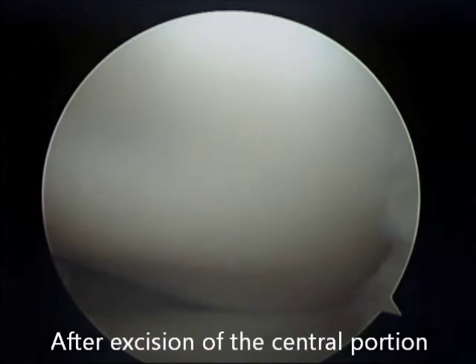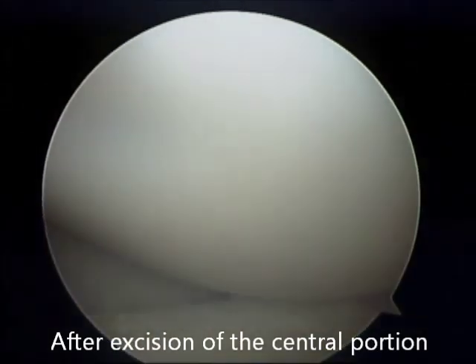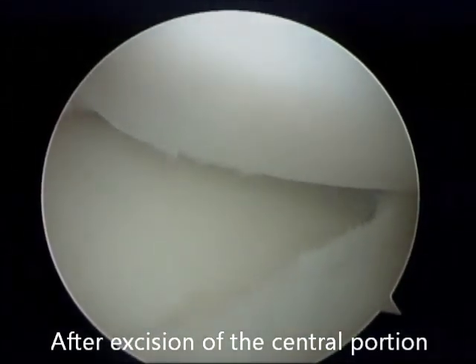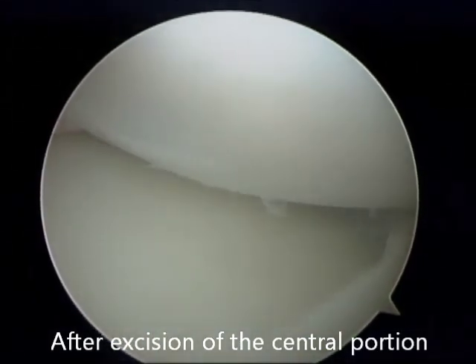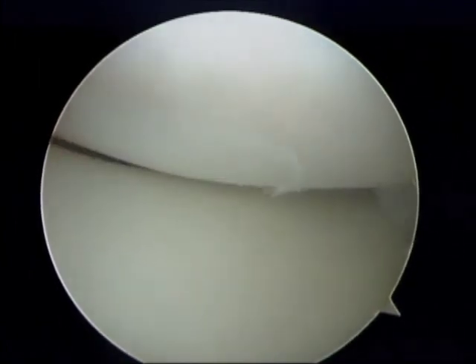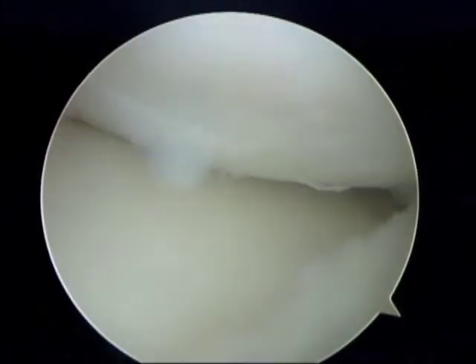However, after excision of the central portion of the discoid lateral meniscus, we can see the normal movement of the remaining meniscus without snapping, as in case 1.